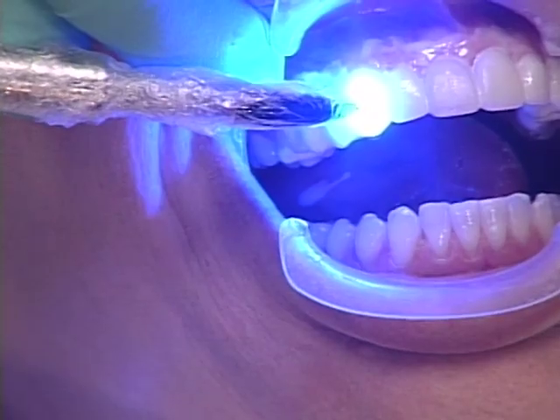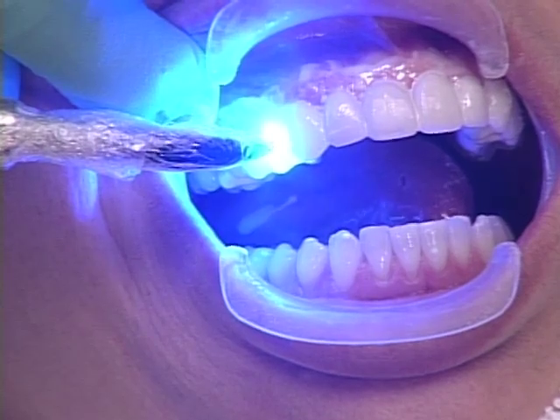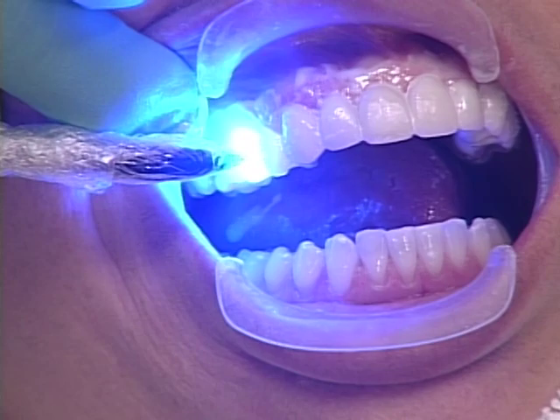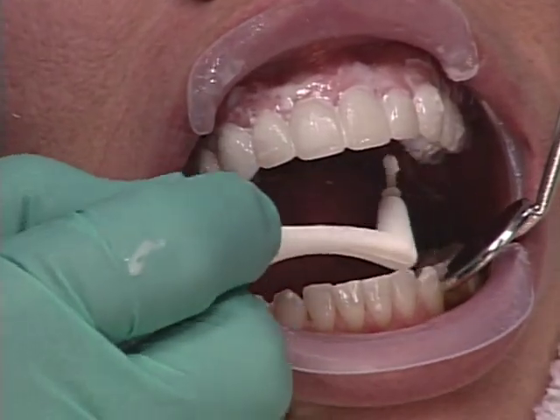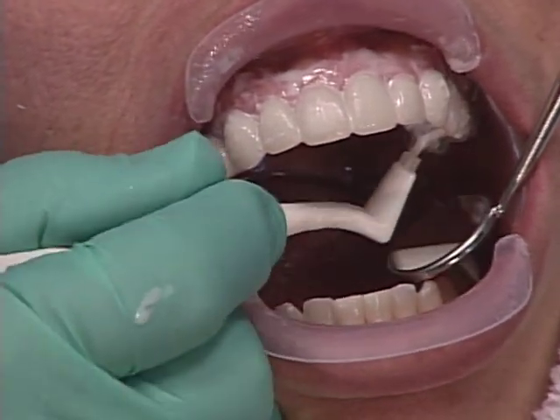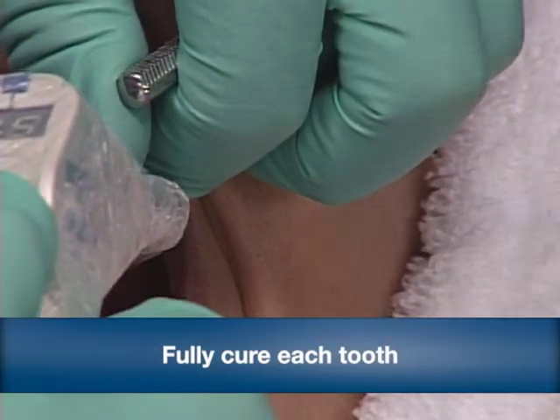Close your eyes. Now I'm taking off the excess on the lingual side.